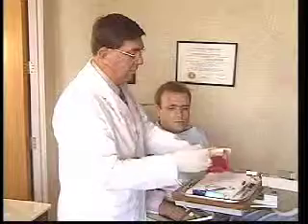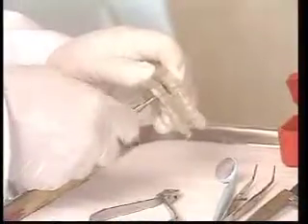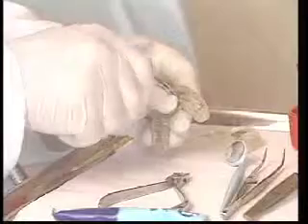When the patient's silencer comes back from the lab, it is assembled. Disassemble it using the supplied screwdriver. The screwdriver has a 1.5 millimeter hex which is not readily available. This helps deter patients from attempting to adjust the appliance themselves.